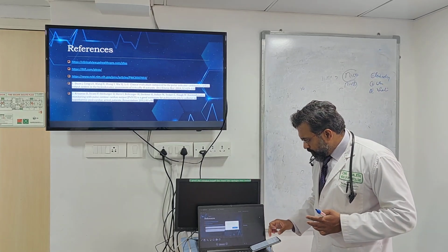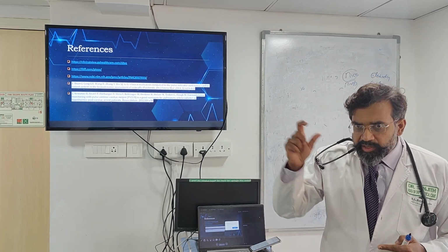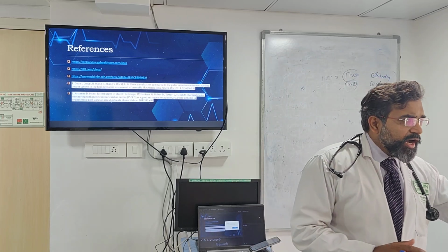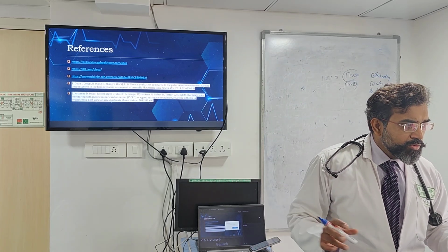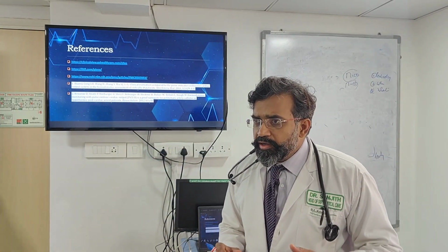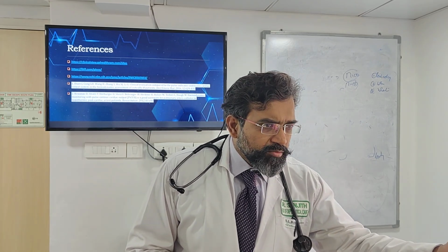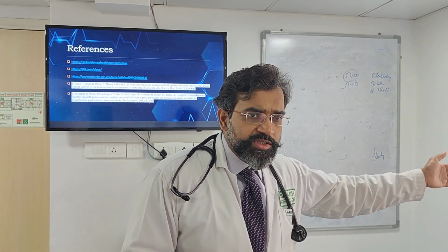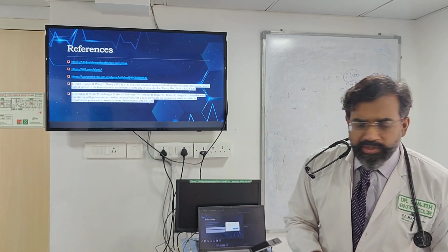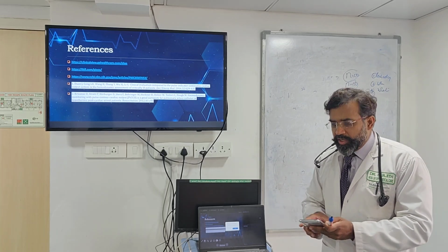Right. Then, when you say cardiac output, there is no normal value. You will not say 2 is normal or 4 is normal. It is normal for that time. If the person is running around, 7-8 liters is different. If the patient is hyperdynamic, 8 liters can be normal for that patient. There is no normal value for cardiac output monitoring. So that's why it's important that you trend these values to understand what is happening to this particular patient.